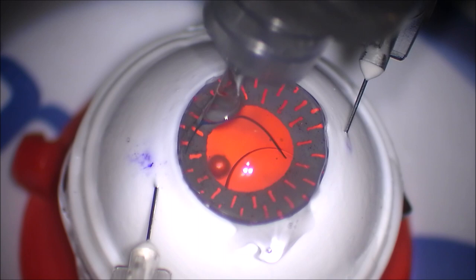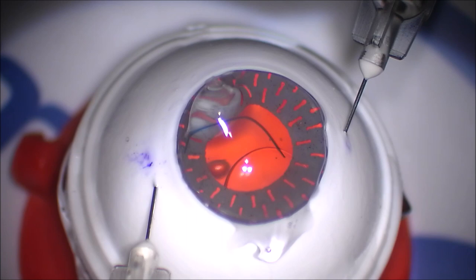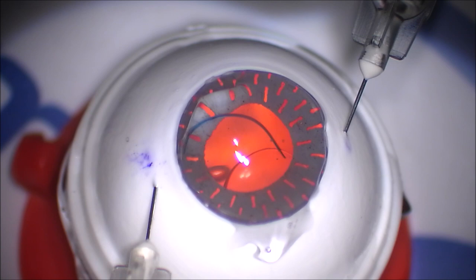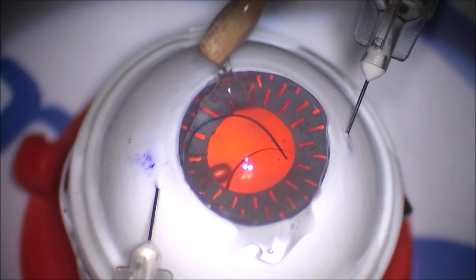So this is my first attempt using the Guter Yamani double needle stabilizer with the J&J sensor IOL. As you saw with my trailing haptic first modification, I'm able to cannulate the haptic through the needle very easily, docking the haptic on the bevel of the needle, flattening it out, and then cannulating it very easily.